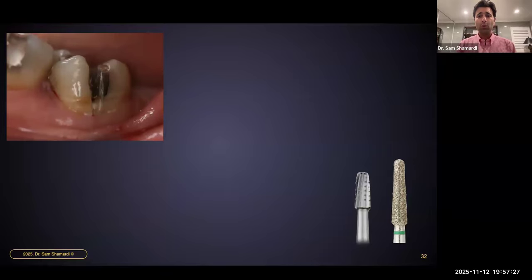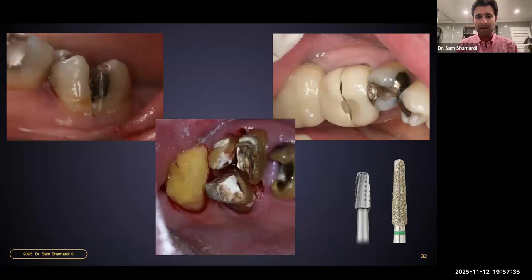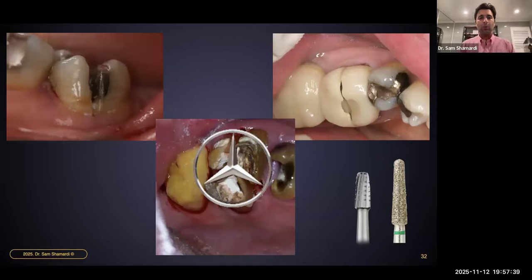So as mentioned, whether it's crown, natural tooth structure, or a crown material, we're going to use our burrs to create that sectioning. Here again, you can see what that maxillary molar looks like with our Mercedes-Benz symbol, where now we've got three individual parts that we can atraumatically go after one at a time rather than one big bulky area that's going to be decayed, that's going to be brittle, and that's going to force us to put the majority of our force on that buccal area.